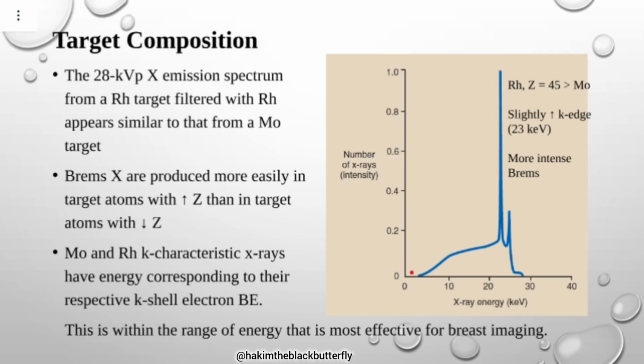The low and also the high energies are suppressed, but the suppression is somewhat higher than what we saw in molybdenum, because in molybdenum, the suppression of higher energies was at 20.